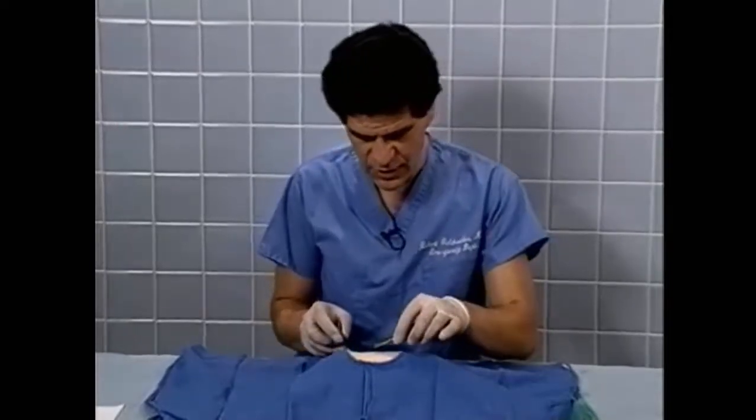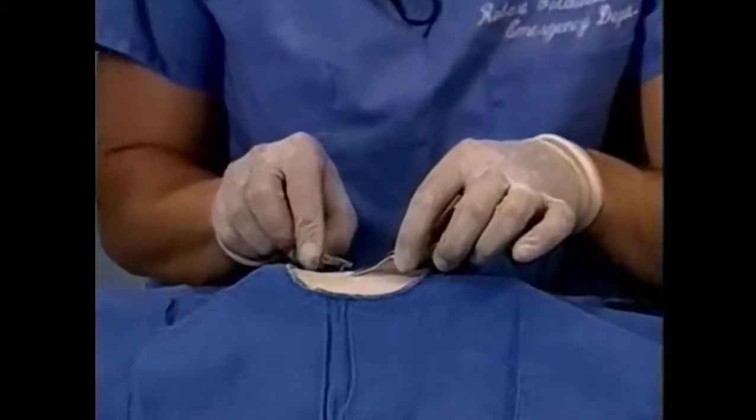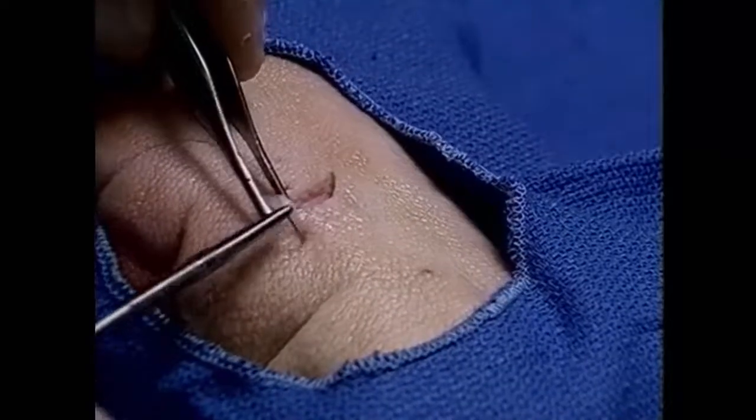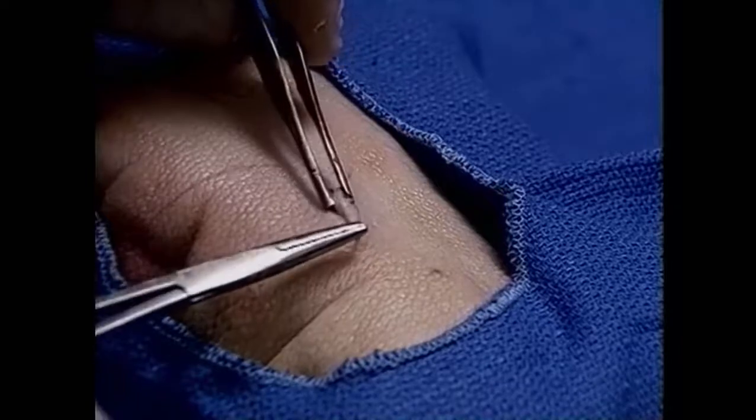Subcuticular sutures are excellent for obtaining very good cosmesis, especially on face lacerations. If this is the laceration, one would enter proximal to the wound, exiting inside the wound just under the dermis.